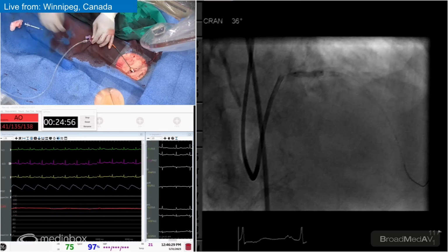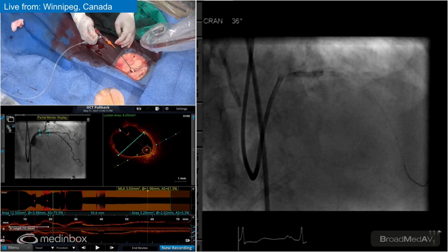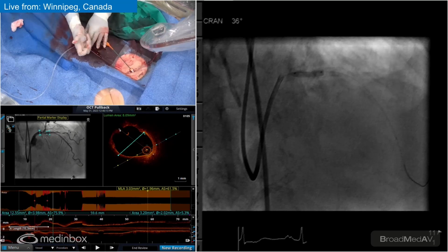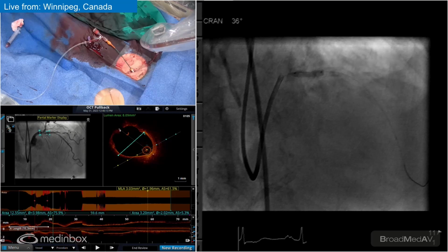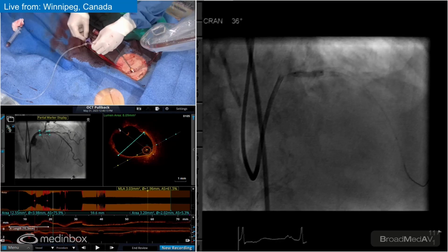How you feeling? Yes, it's going real well, ma'am. Christian, can we get another round? Let's get one for the patient too. Here's the ACT on the corner there. Some nitro too. Let's do some nitro. Blood pressure's like... Yeah, let's go with 200 of nitro as well. Perfect. Let's shoot it in. Perfect. Let's go with the stent.